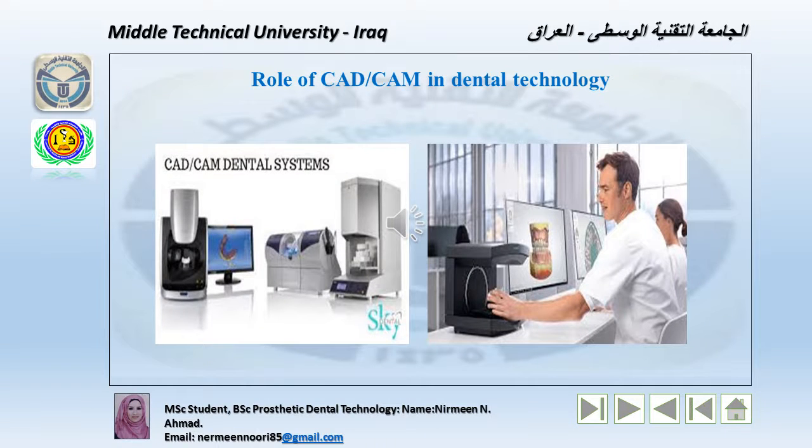Role of CAD-CAM in dental technology. Computer-aided design and computer-aided manufacturing is utilized in many fields besides dentistry. In the manufacturing industry, a highly detailed CAM method is used to produce a prototype. Several authors have suggested that CAD-CAM may improve the accuracy of dental implant planning and placement, an extension of this application, and the ability to fabricate dental prostheses prior to the implant surgery.